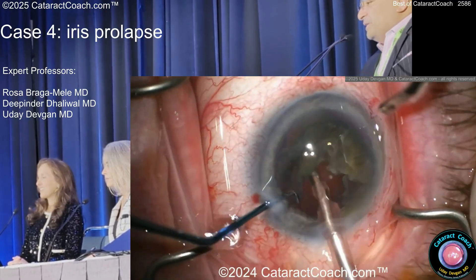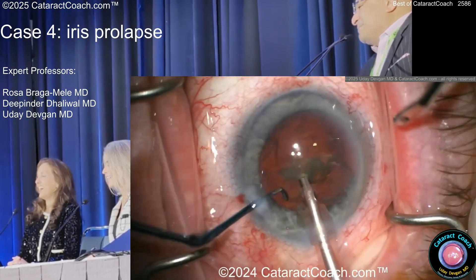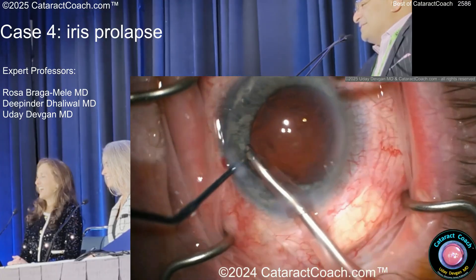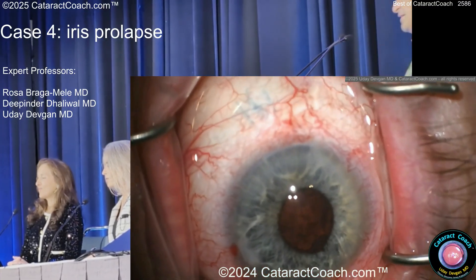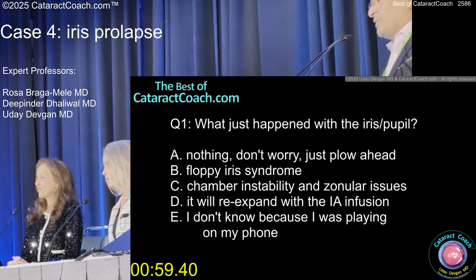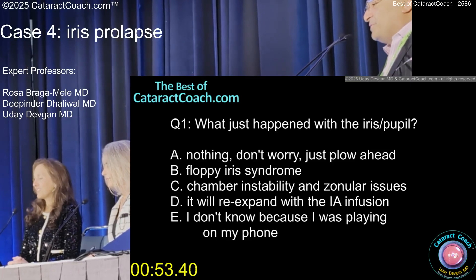The surgeon's really good — short work of that nucleus. This isn't even sped up... just kidding, it's sped up. No one wants to watch this in real time. That's all cleaned up nicely. Now what does that tell you? What happened with the iris and pupil? Floppy iris, chamber instability, zonular issues. It'll re-expand with eye infusion.